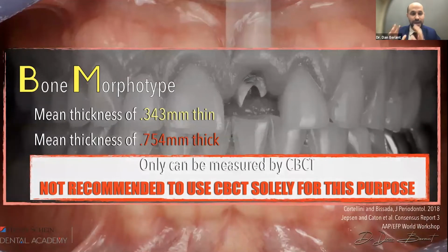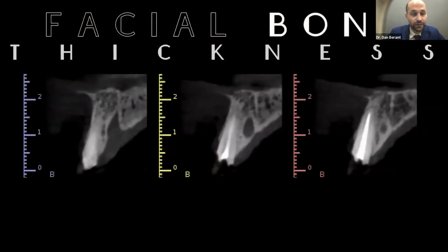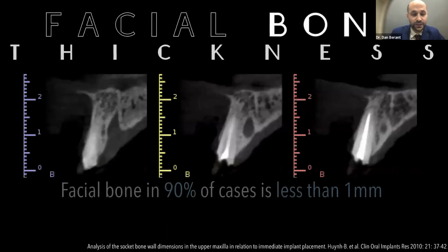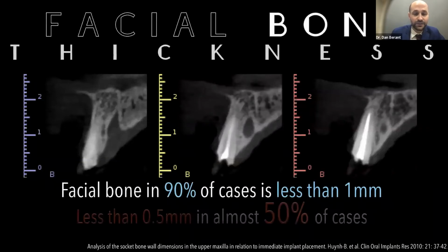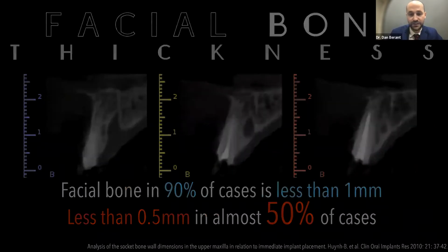And I want to emphasize that just because you want to know a patient's bone morphotype doesn't indicate a reason to take a CBCT. In this case, we are justified to take a CBCT because we need to know what the bone is like in order to place our implant. Now, we know from several studies that the facial bone in 90% of cases is less than 1 millimeter. And in 50% of cases, it's less than 0.5 millimeter. This is the CBCT of our patient who, even though she had a thick gingival biotype, you can see how thin her bone is on the CBCT.